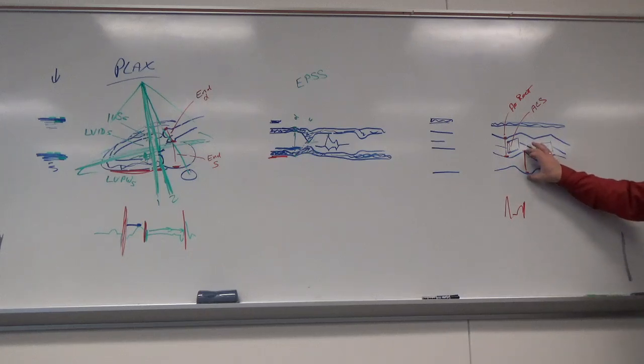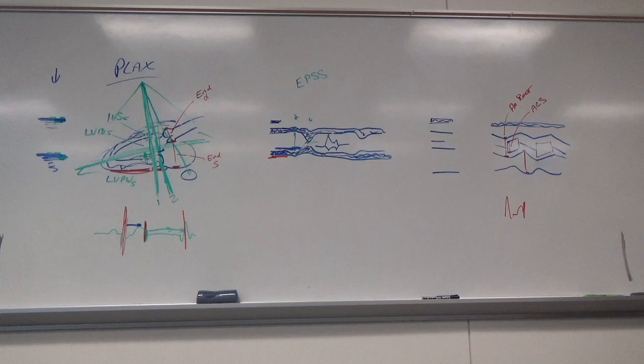And then the left atrium, you're going to see when it's the biggest. We want to measure the chamber size when it's biggest. Oh, and that's the left atrium. Yes, sorry, I didn't label the left atrium.